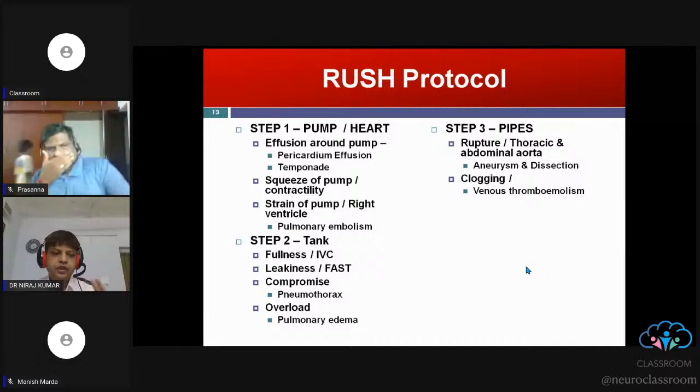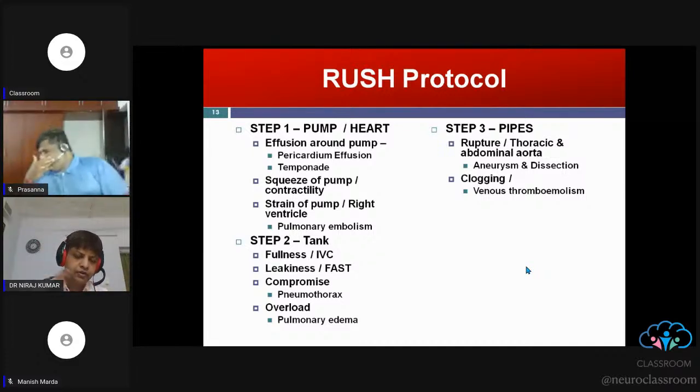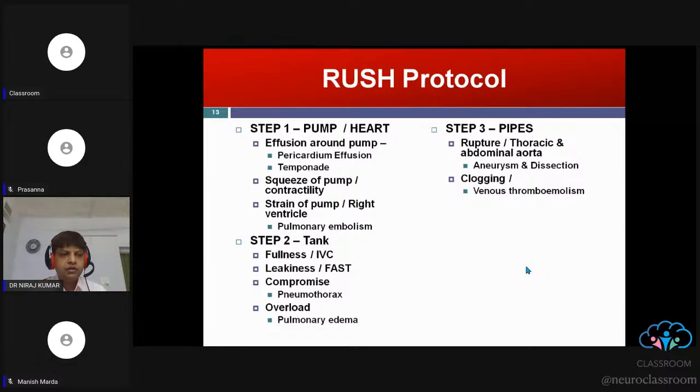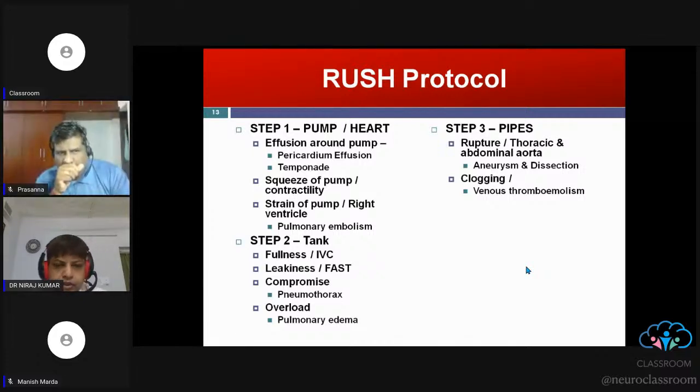So remember, the heart is a 3-dimensional structure, and you are seeing the heart through various 2-dimensional cross sections. So you have to assimilate all the 2-dimensional cross section images to imagine a 3-dimensional picture of the heart in your mind.